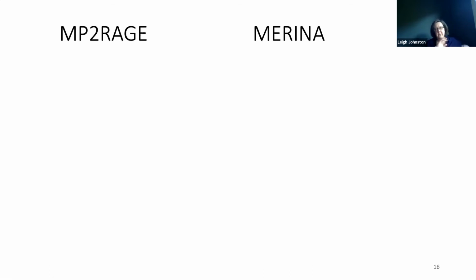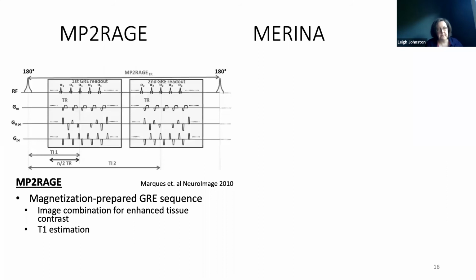Okay, so we've got MP2RAGE, which is a stock standard proton scan that we do. Every person that comes in gets this scan, no matter whether they're doing functional, diffusion, whatever. We do a beautiful T1 weighted anatomical scan. That's called an MP2RAGE.